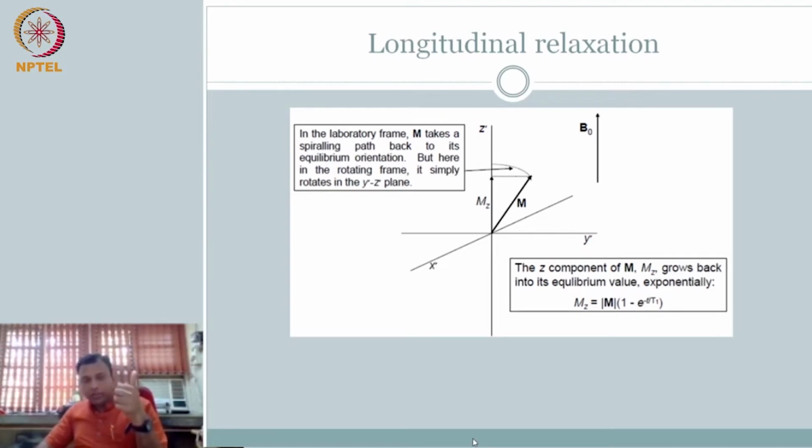Now, in addition to that, we have talked about the decay, the relaxation time itself is a characteristic of the sample material. Okay, so there is T2, and then there is T1. That is also the sample's ability to lose, right? Some materials lose fast, and then they come back to the equilibrium faster. It has to do with the energy loss. So this is also a material property. So now we have different material properties, which are all somewhere there. But how do we measure this at each location? That is going to be the challenge that we are going to talk about.